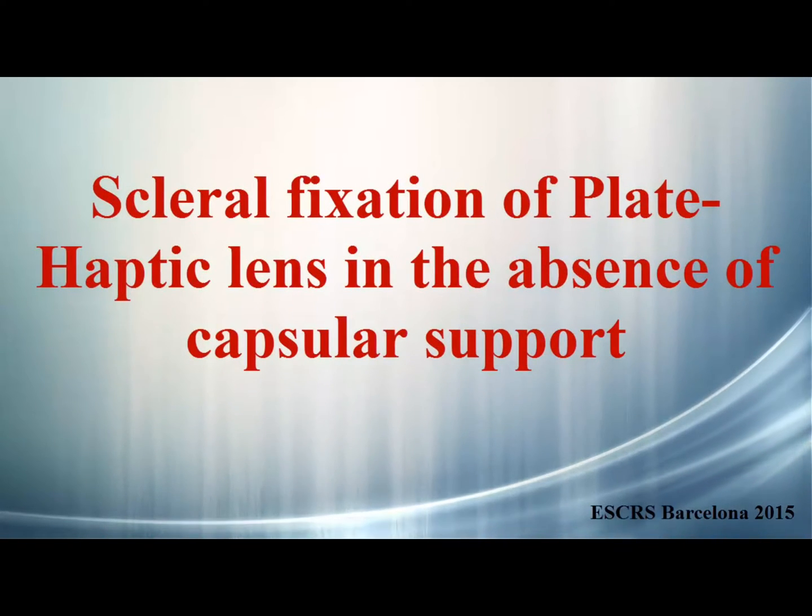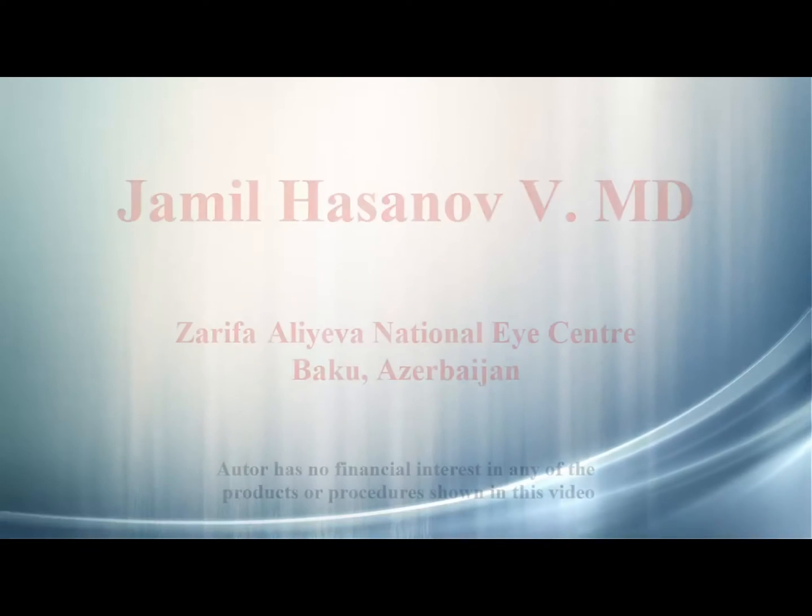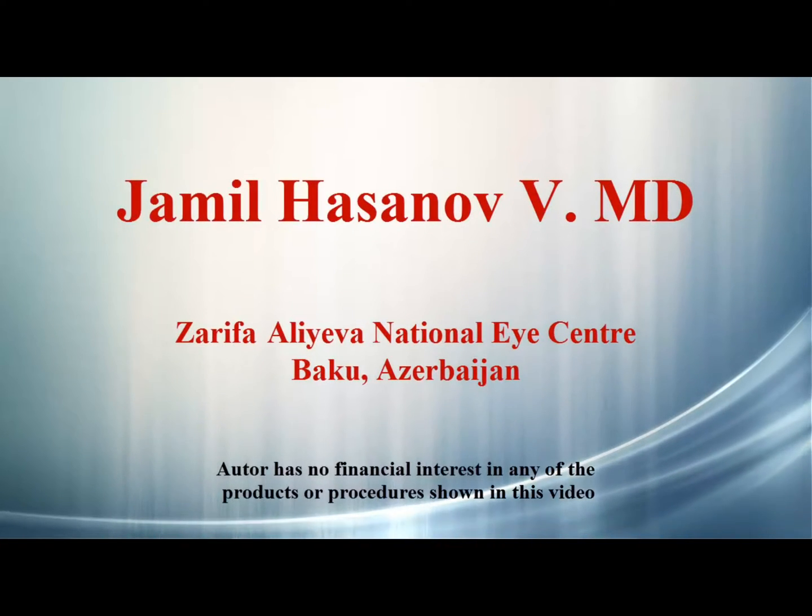Scleral fixation of plate haptic lens in the absence of capsular support. The author has no financial interest in any of the products or procedures shown in this film.